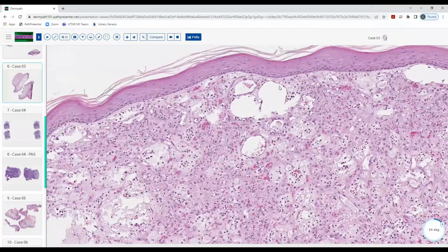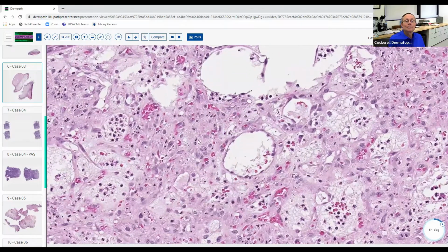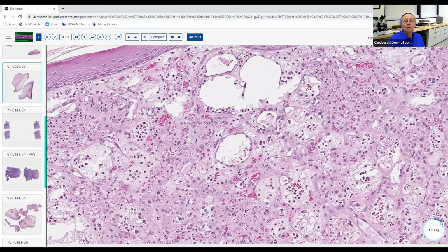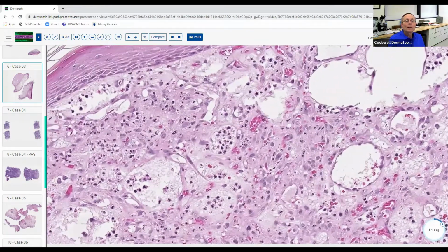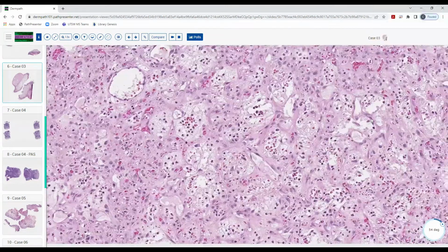I mean, there's neutrophils in there. Good. And I don't know, are those little vessels or blood vessels? Yes, there are lots of blood vessels. And over here, you can see that they're kind of almost forming a little lobule, if you will. We sometimes refer to that as lobular capillary proliferation.